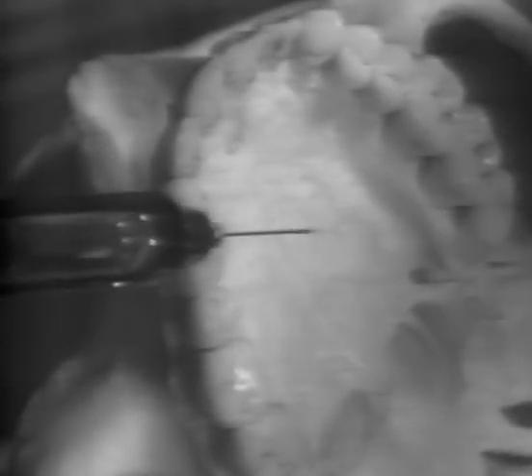Now observe the anterior palatine nerve block administered on a skull. The needle approaches the penetration site from the opposite maxillary premolar area so that it will be as nearly at right angles as possible to the tissue at the penetration site. The solution is deposited just anterior to the anterior palatine foramen.